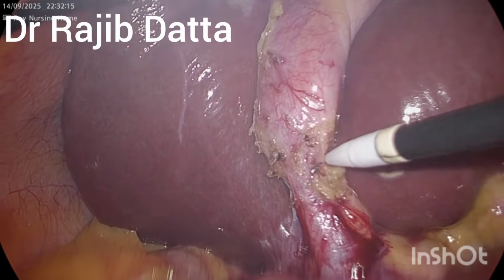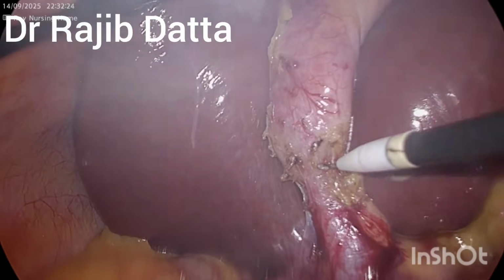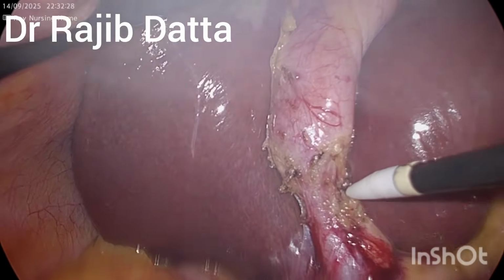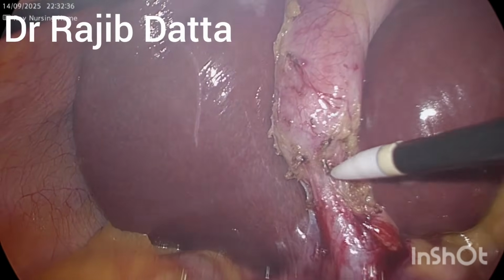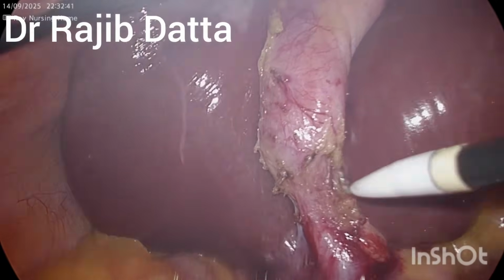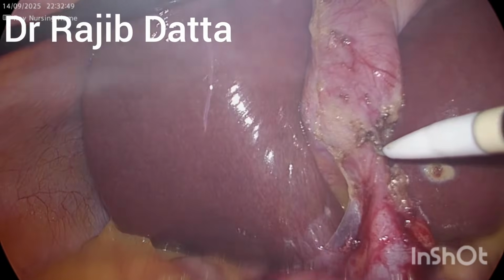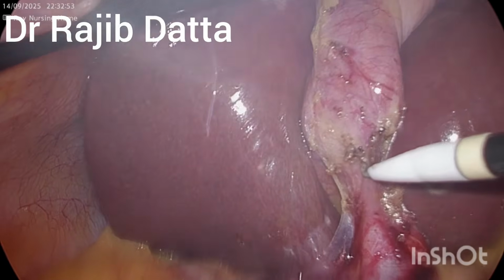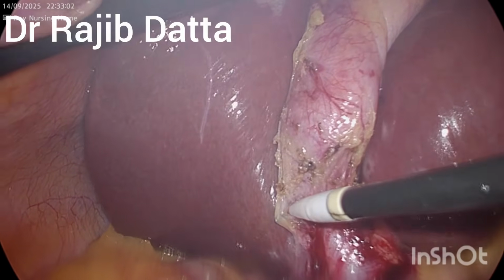The hook is an excellent instrument for such small and precise work, and also the bipolar shearer. But initially in this case I am using the hook for its handiness, as it is a handy instrument.